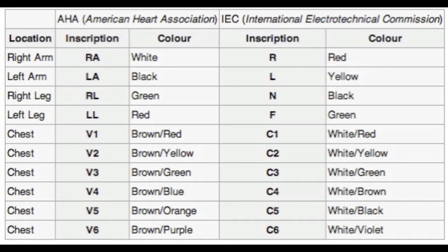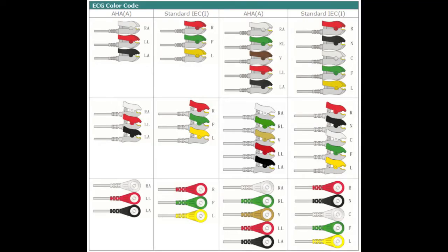What you're going to notice is that the location matches the inscription, which matches the color on the lead. For instance, right arm is indicated by RA or a white color-coded lead. Left arm is LA, indicated by a black colored lead. Right leg, or RL, is green. Left leg is LL and is red. Looking at the IEC standards, the inscription is R for red, L for yellow, N for black, F for green, and then some combination of white and a color for C1 through C6. You can see why it's a good idea to become familiar with these colors and inscriptions, and maybe have an easy reference table.